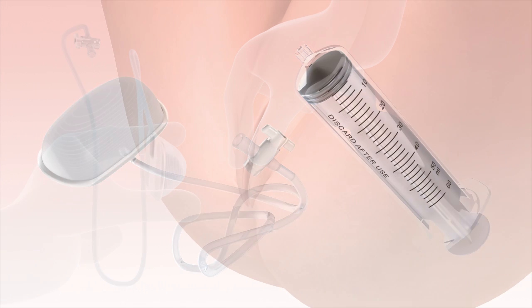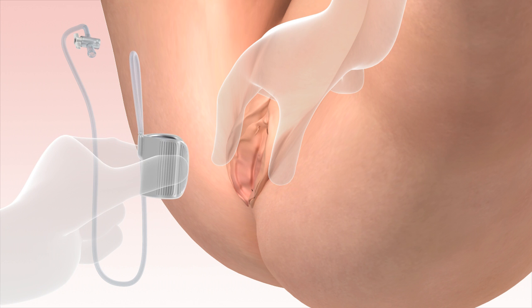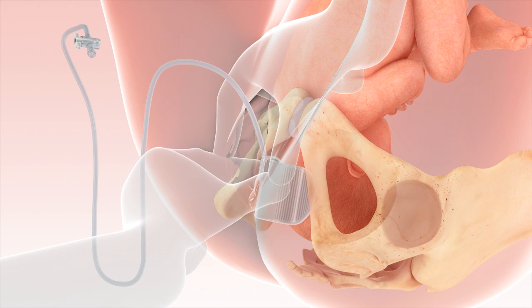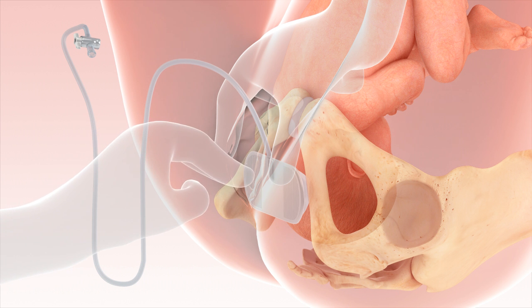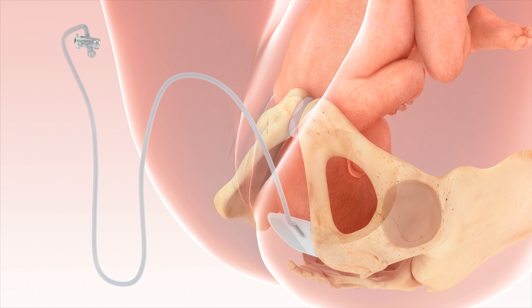Fetal Pillow is inserted vaginally prior to starting the caesarean section in the second stage of labour. For insertion, use sterile jelly or obstetric cream. Hold Fetal Pillow in the hand with the base plate folded along its short axis. The tube attachment should be facing upwards and the balloon surface should be in contact with the fetal head. Once inserted, the device is pushed posteriorly like a posterior ventouse cup. The base plate is now on the anococcygeal ligament, preventing any significant downward movement during inflation. Now place the legs flat.